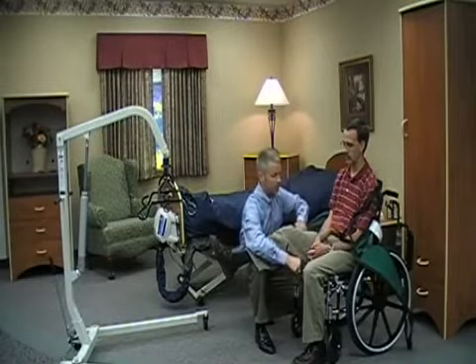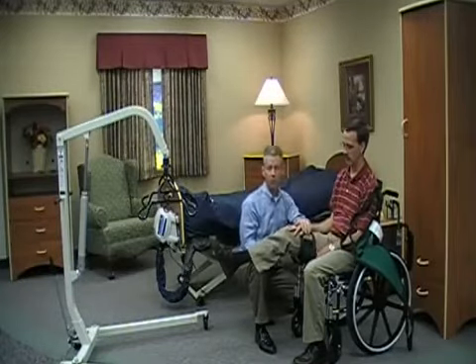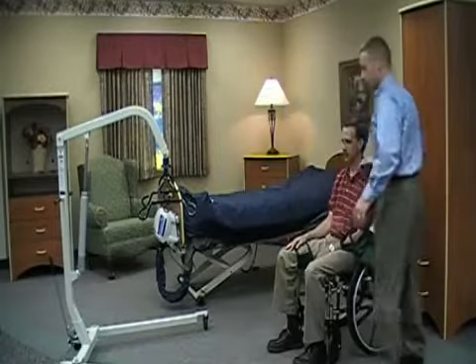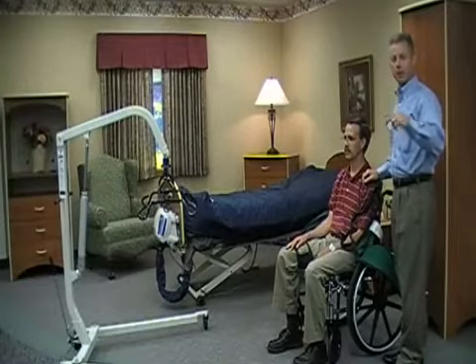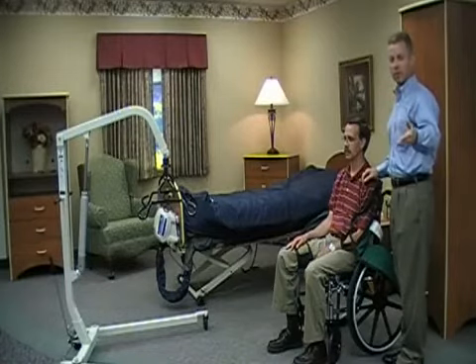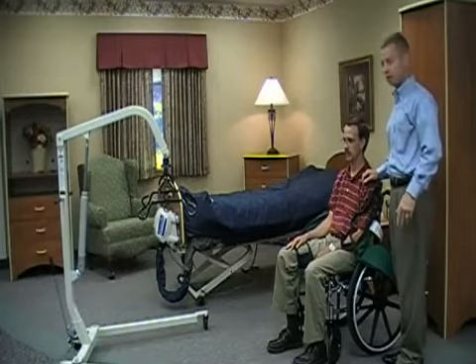I'm going to use my hand to move that in place so that we don't create any friction, and once I do that, I'm just going to put the resident's hand there and move to the other side. The other thing that's important to know is, depending on the facility's requirements, either one person or two people may be mandated for doing transfers. In this instance, I'm doing the transfer by myself, but depending on the facility requirements, you may have two staff members or two people facilitating a transfer.